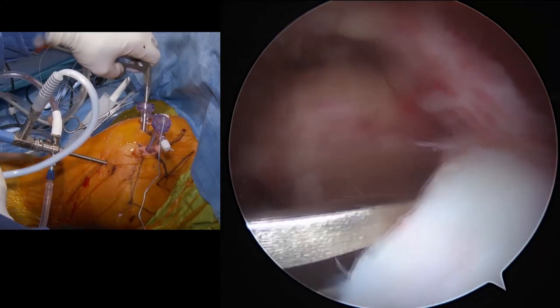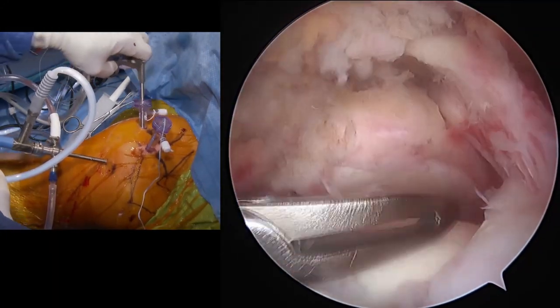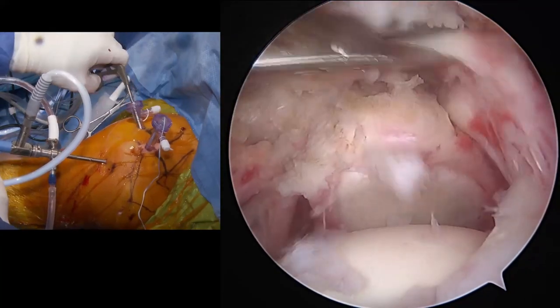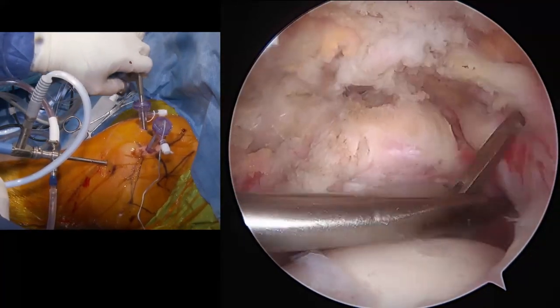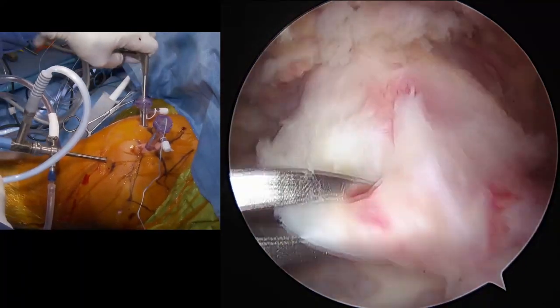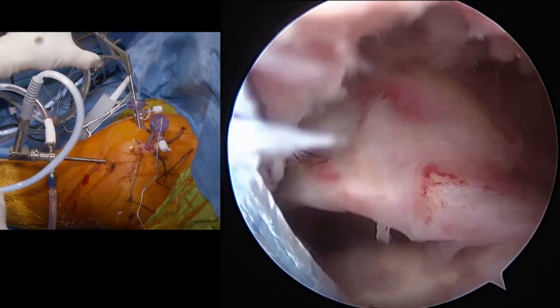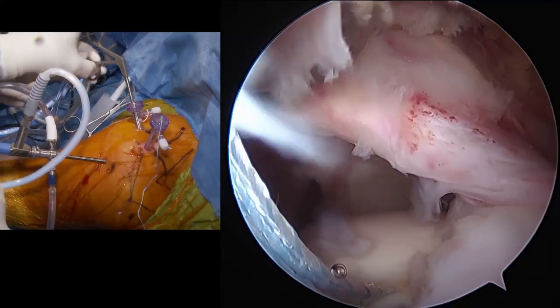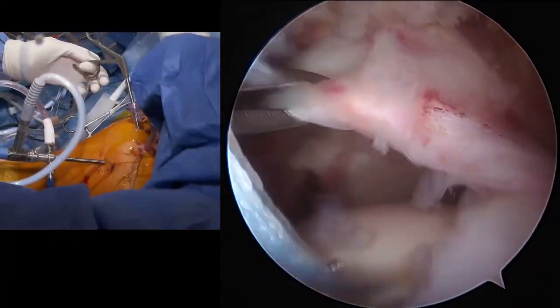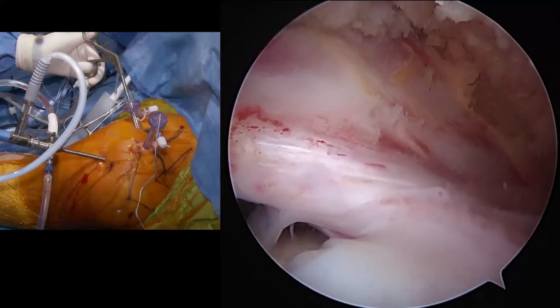So as is typical with rotator cuff tears, they don't tear just from lateral to medial, but they also roll off the back or posterior. And that's what we're witnessing here. The supraspinatus is rolled back with the infraspinatus, and this is what has to come all the way over. So just pull forward like this for me on the kingfisher. You've got to pull harder than that. Okay, and we've got to get that back in that tissue there.